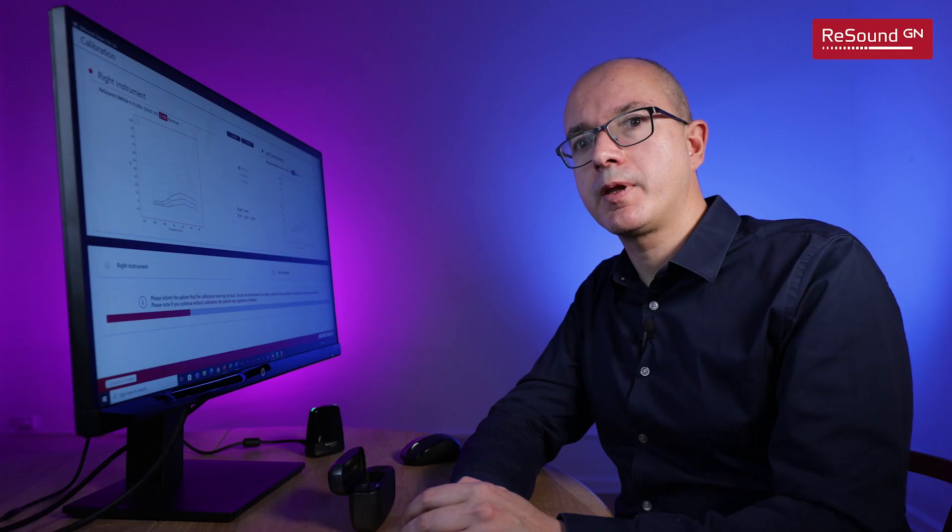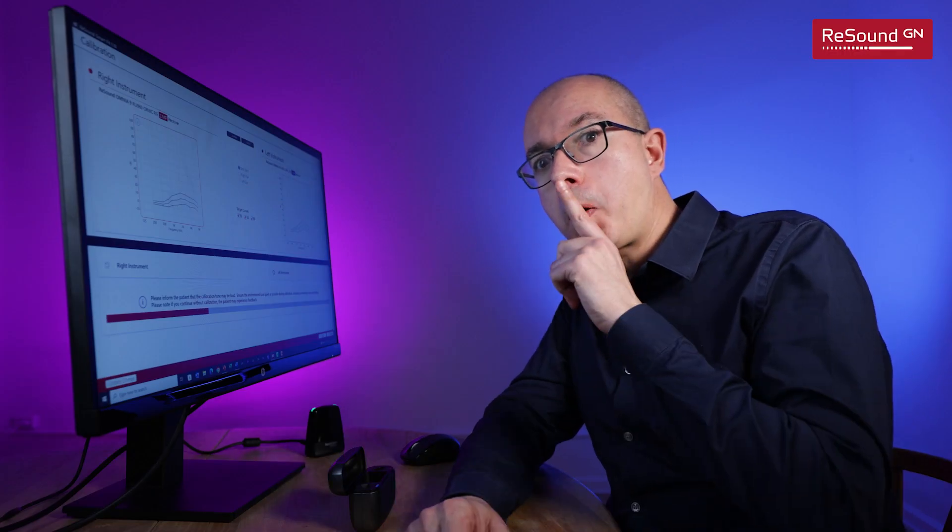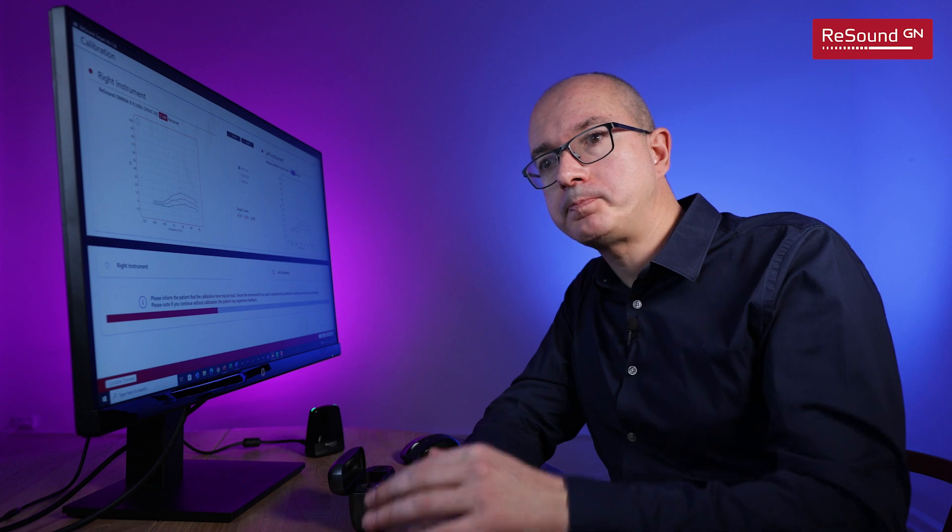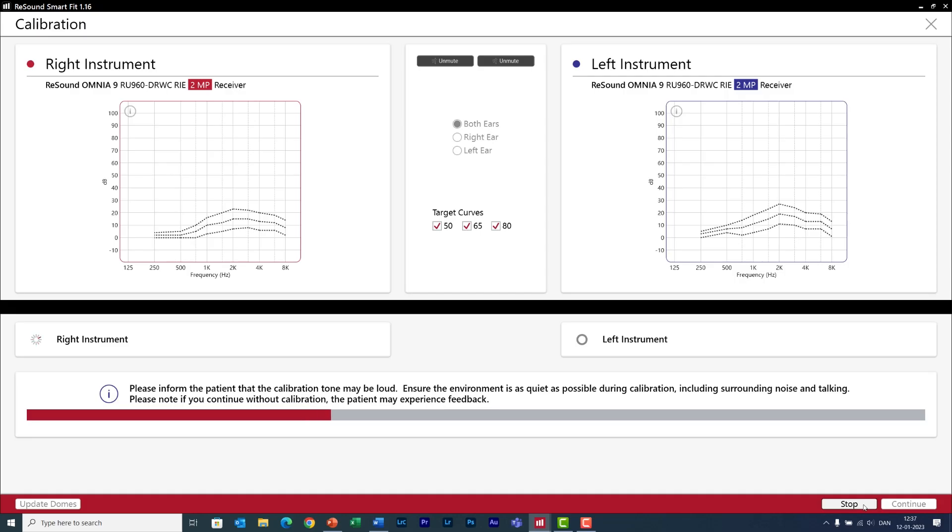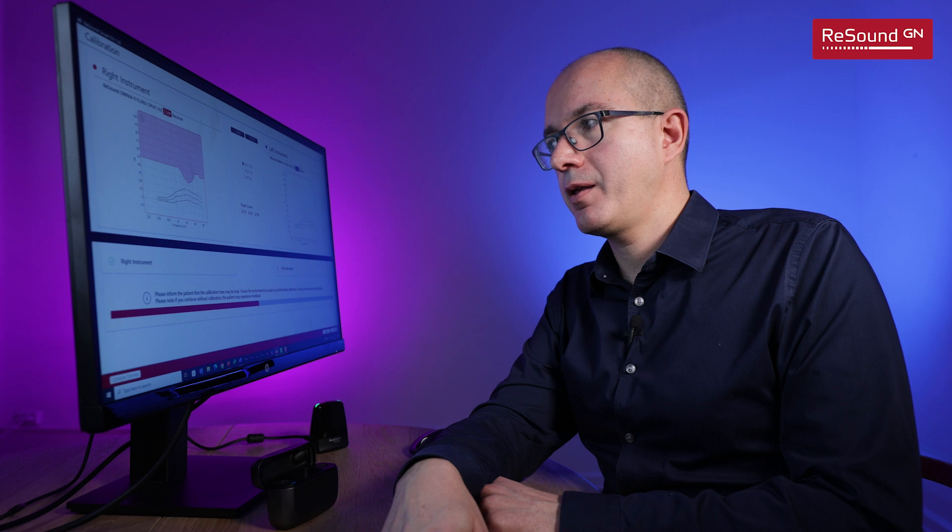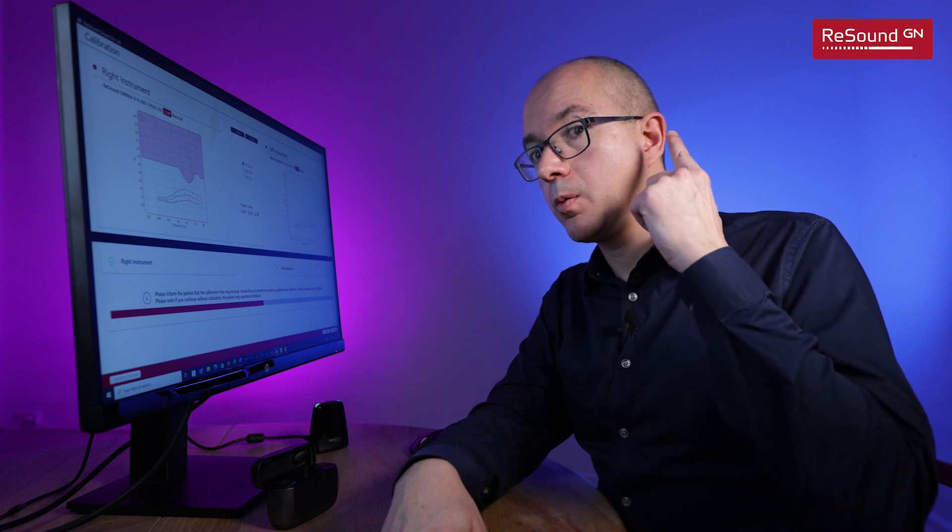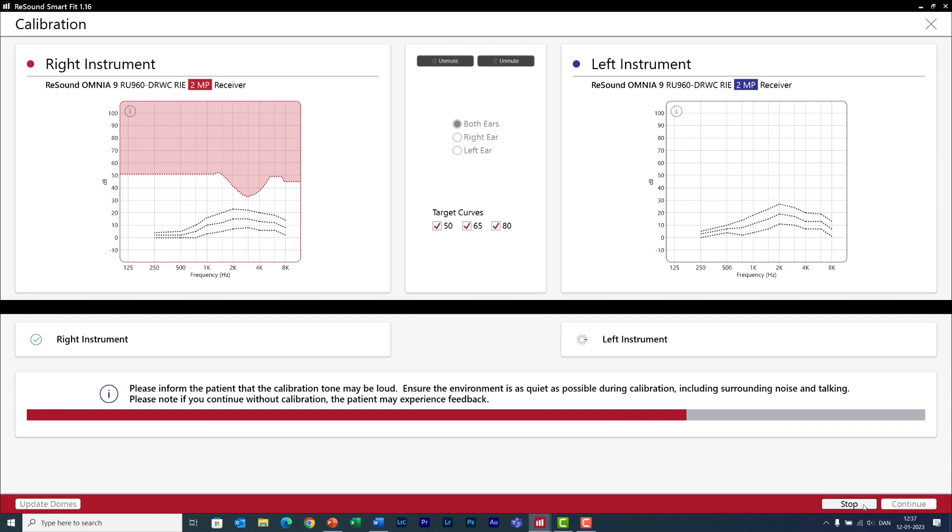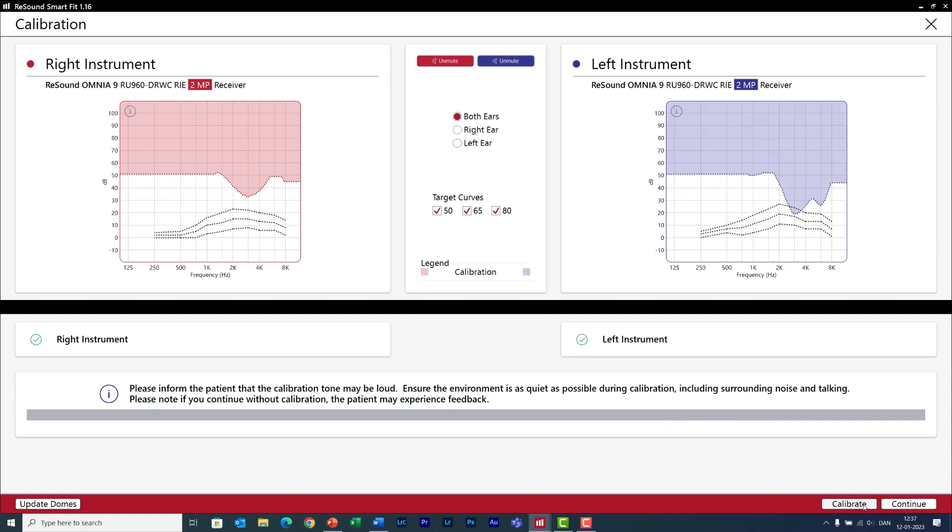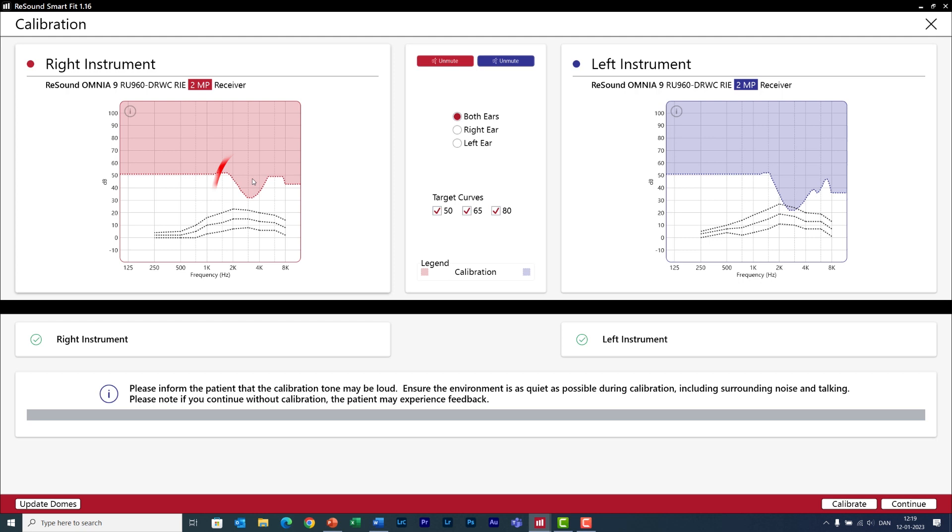During calibration the environment must be as quiet as possible. It is also important that you inform your patients of what's going to happen because they also need to keep quiet. Tell them that this process takes just a few seconds and it is important to ensure that the hearing aids are perfectly fitted to their ears so that they can get the best speech clarity without feedback. And that's it! Here we have the results of the calibration.